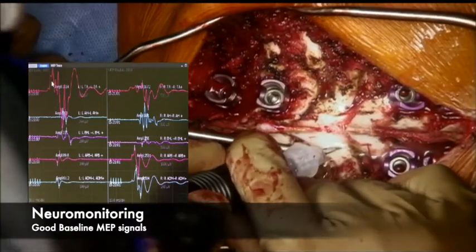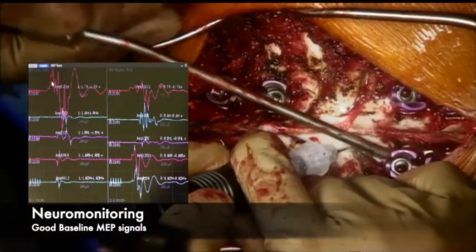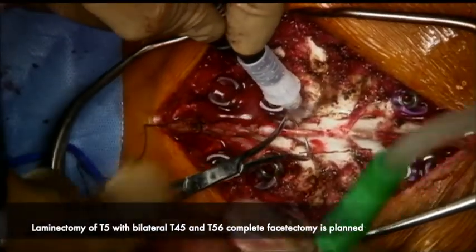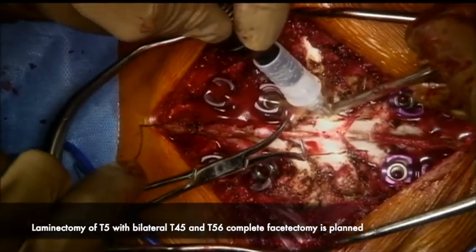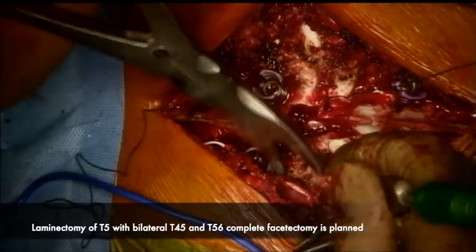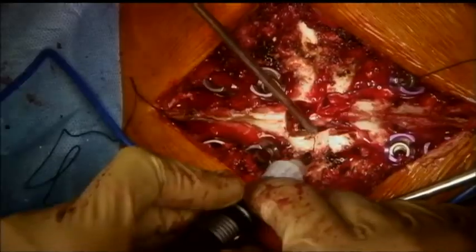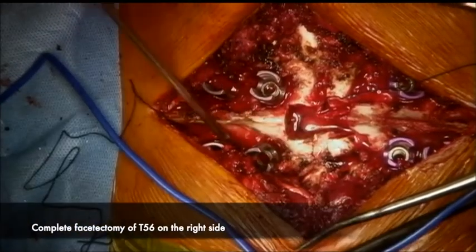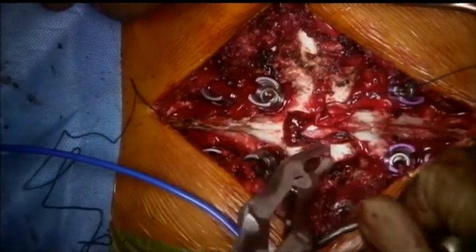A laminectomy of T5 is performed using an ultrasonic bone scalpel. A part of T4 and T6 lamina is also removed with it. T4-5 and T5-6 bilateral complete facetectomy is planned. After removing the transverse process of T5 and T6, a complete facetectomy of T5-6 is being performed.